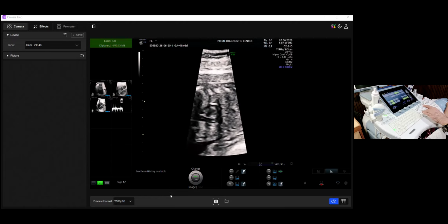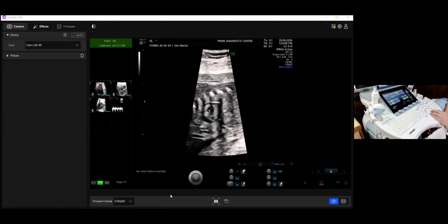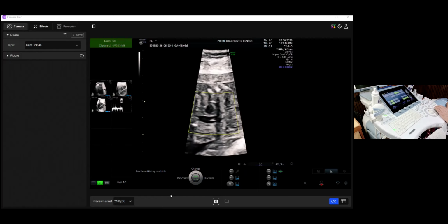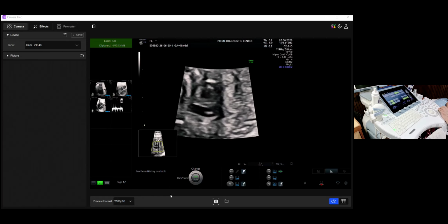And the structure here is a circle, and this is a kind of banana, and this is the RV, and this is the LV, and you see this saucer and circle shape. Let me zoom it for you. And if you are lucky enough, then you can see the papillary muscles.